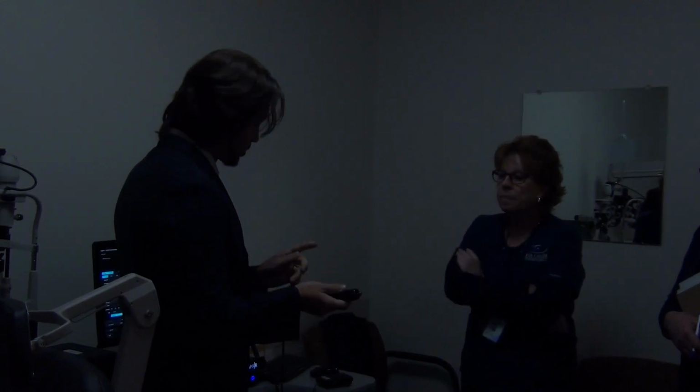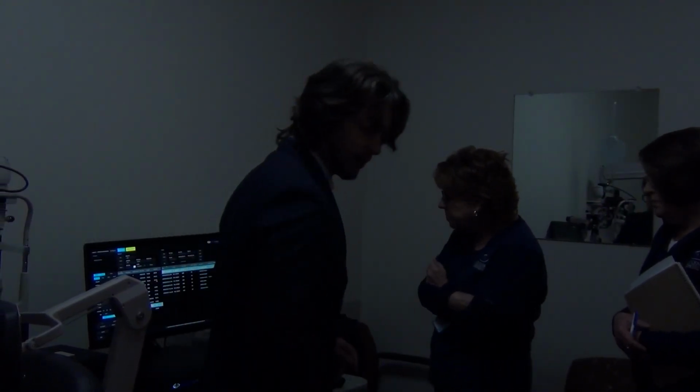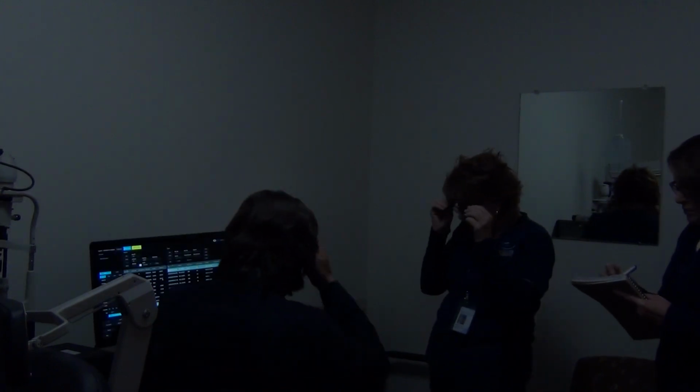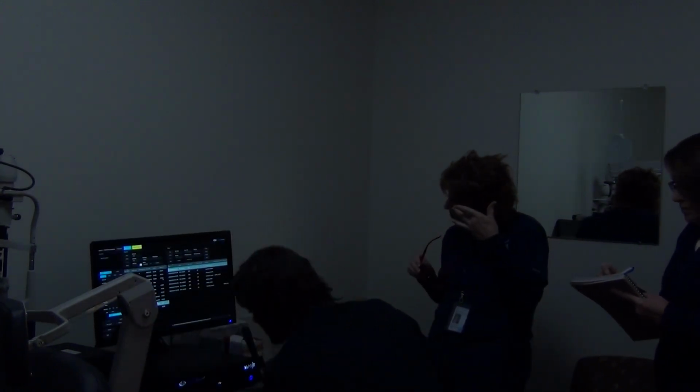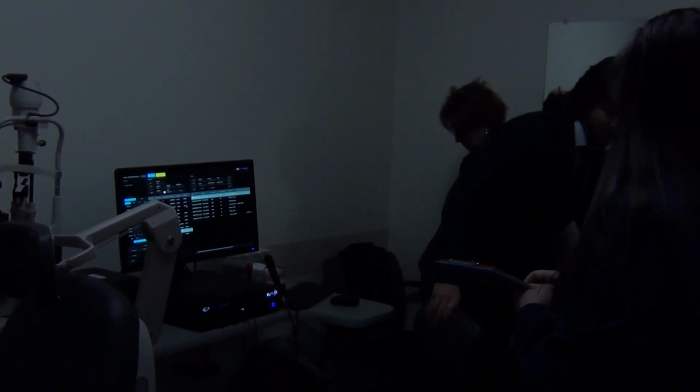All right, so you know how to switch cables, right? Yes. Okay, good. Set this one aside. If you don't mind, I don't want to cover the view. So you go from this side. I'll let you stand up here or sit down, maybe even better. You'll be more comfortable with that, I guess. Let me just bring all the chairs for now. Just have a seat. It will be easier, more relaxing.